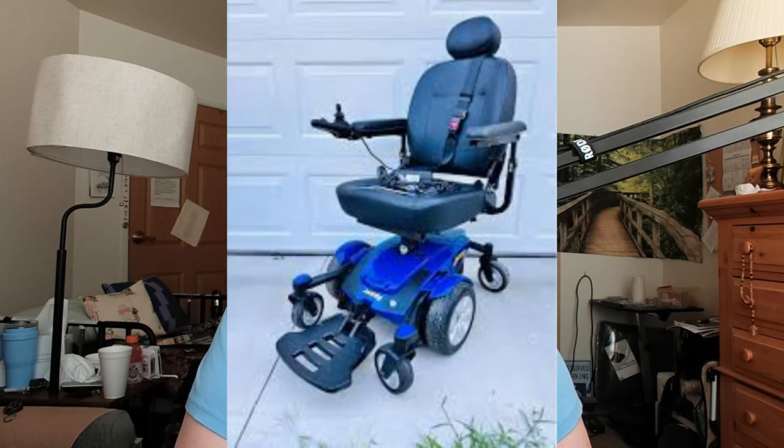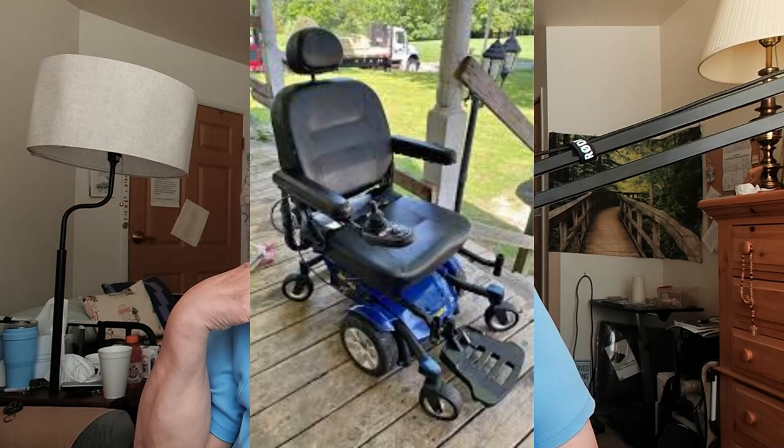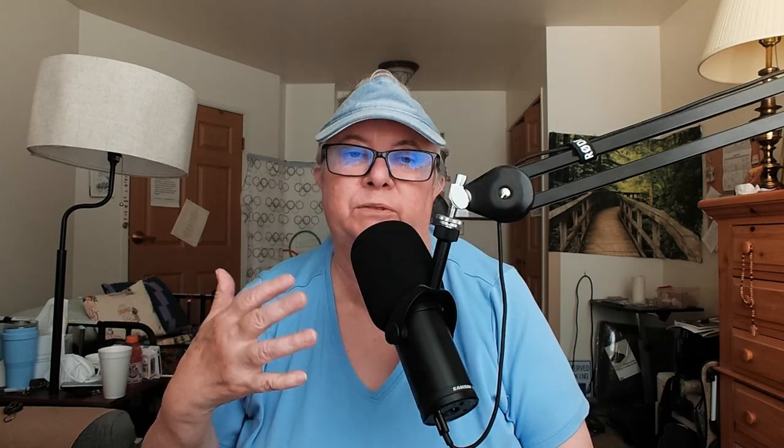If you have issues with your spine or your back, then if you hit bumps on the road, it's gonna hurt. The armrests lift up so that they can be moved out of the way, and that makes transferring easier.